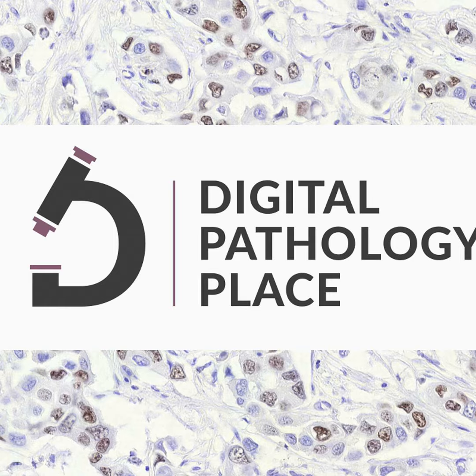And any of my computer scientists, please comment on the domain shift, because when I hear what kind of domain variability sources there can be, I'm like, this is a little bit like IHC magic. Domain shift magic is another magic domain in this digital pathology space. Anyway, however, they are huge, right? So they rely on vast computational resources, and that often limits accessibility and widespread adoption of foundation models.